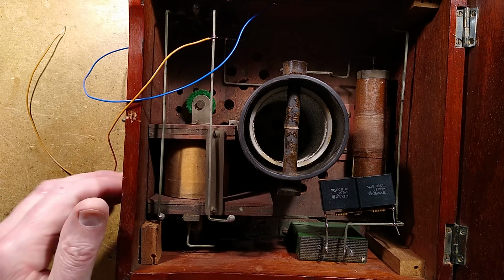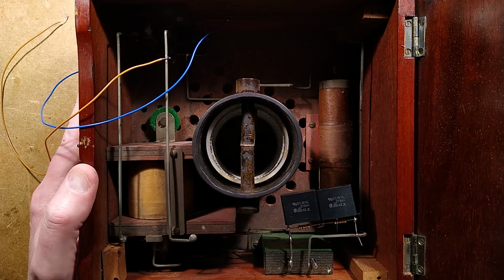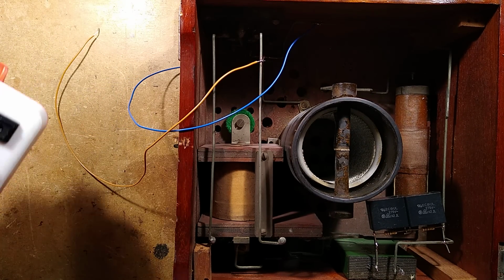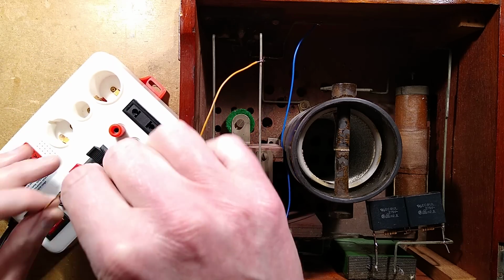Let me bring in, I wonder if we're able to see the violet and the sort of glow of this. I'm not really sure. Let's bring in the electrical tester. I had fears that the high voltage spikiness may upset this little Chinese tester, but it didn't. So this is good.